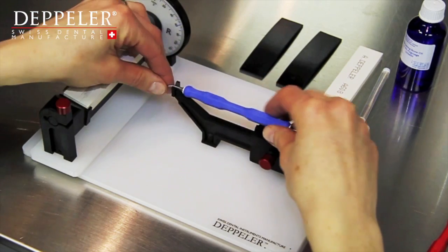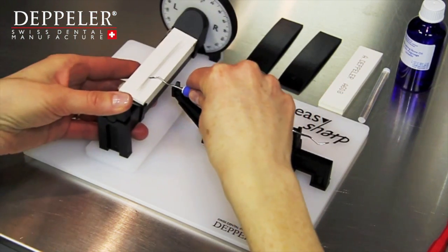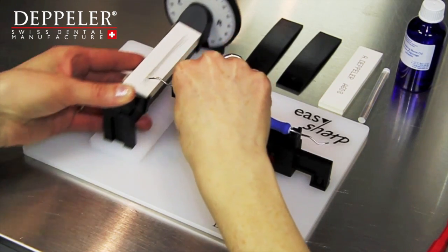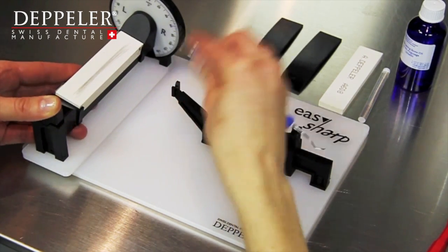Thanks to the EasySharp appliance, your instruments will be as good as new until the end of their life cycle. Try it. You'll be able to appreciate your instruments longer.